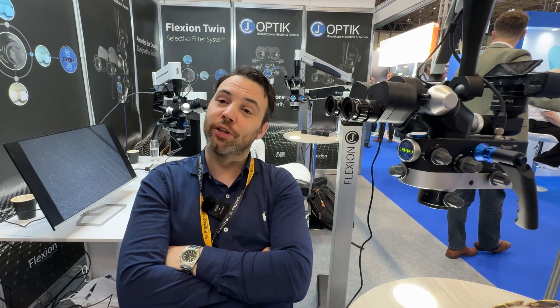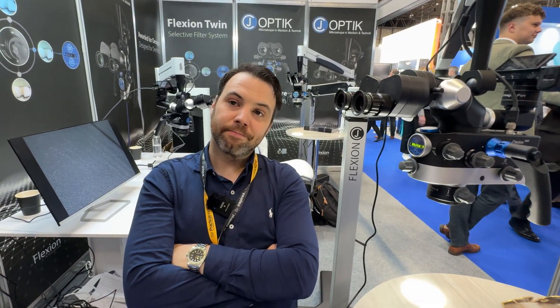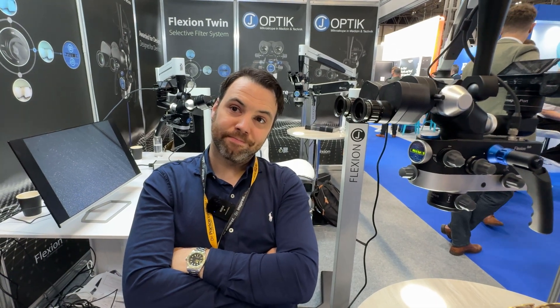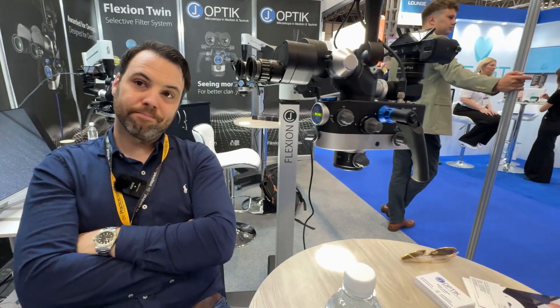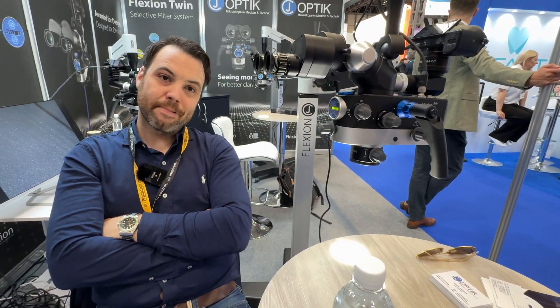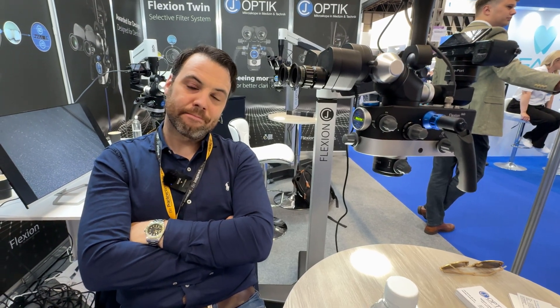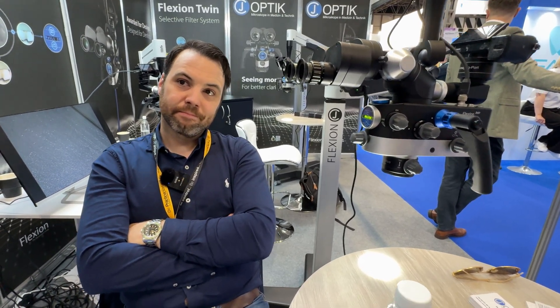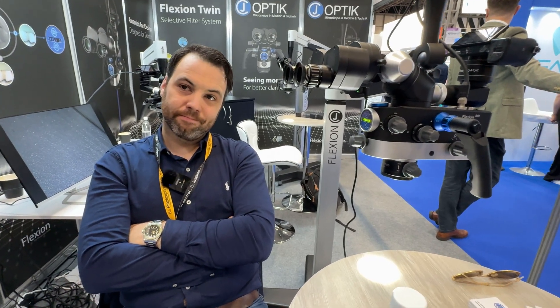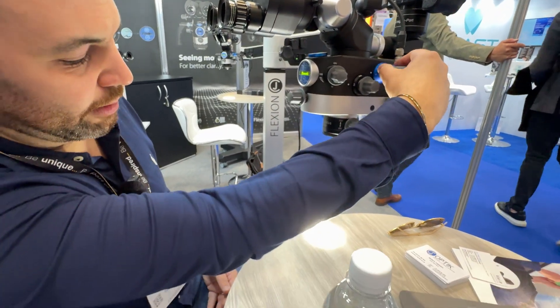What I'm worried about is having the fluorescence and not using it, then regretting not getting the brightness. That's what people have done in the past - they do loads of endo but sometimes some general and some resto. I don't use caries detection dye and I suppose you should be. In the main I am doing general but mainly root canal. It's a tough decision. I was doing an apicoectomy on Tuesday and my scope just wasn't bright enough.